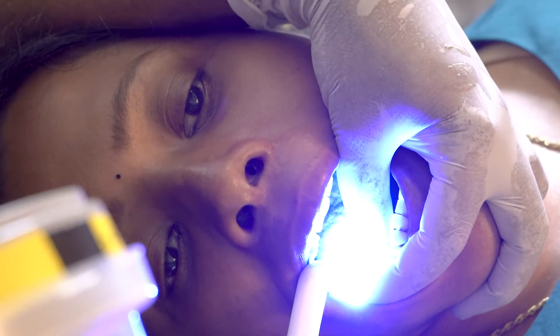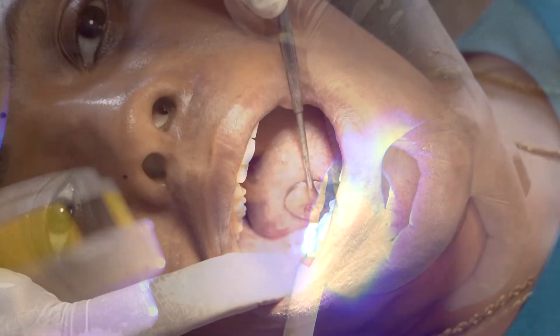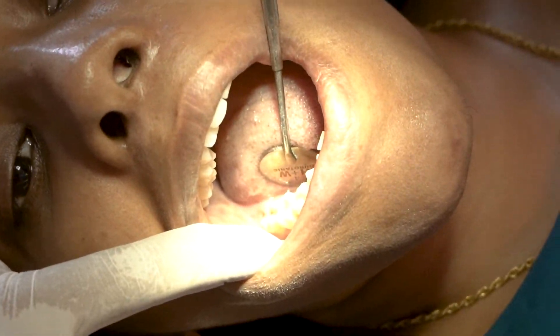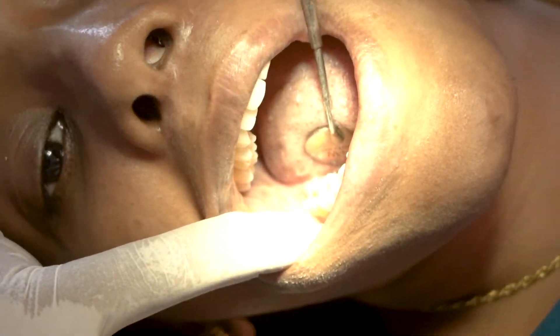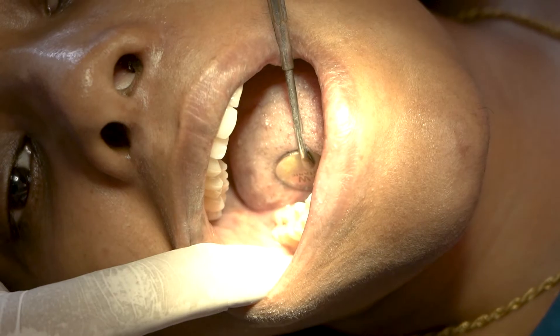The final curing is done, following the protocols. Kindly try and use these files — it will be very helpful for all. Thank you.